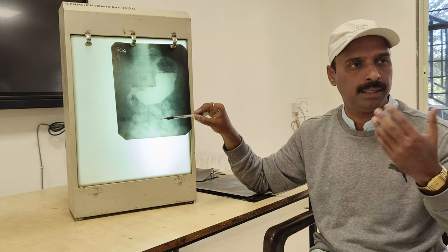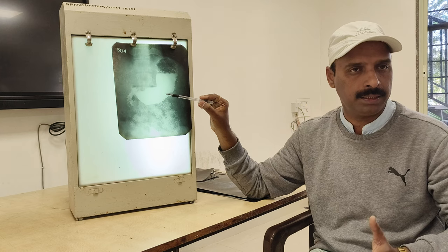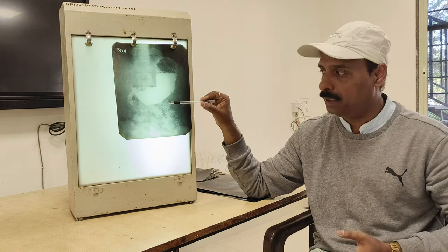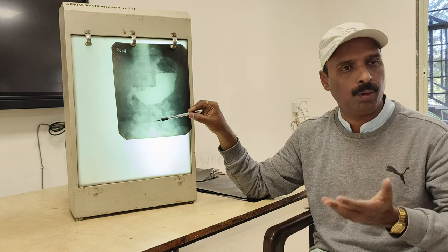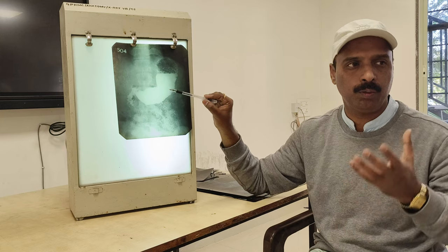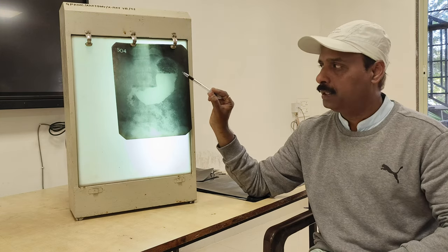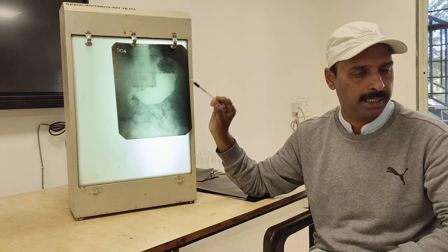When barium enters, whatever the liquid remains about 1.5 to 2 hours in the stomach. Then after 2 to 2.5 hours, it enters into the small intestine. So that is what we call a barium follow through. So in the barium meal, you have to concentrate on highlighting the stomach. Okay. So how are you going to read this x-ray, or what is the comment on this x-ray?